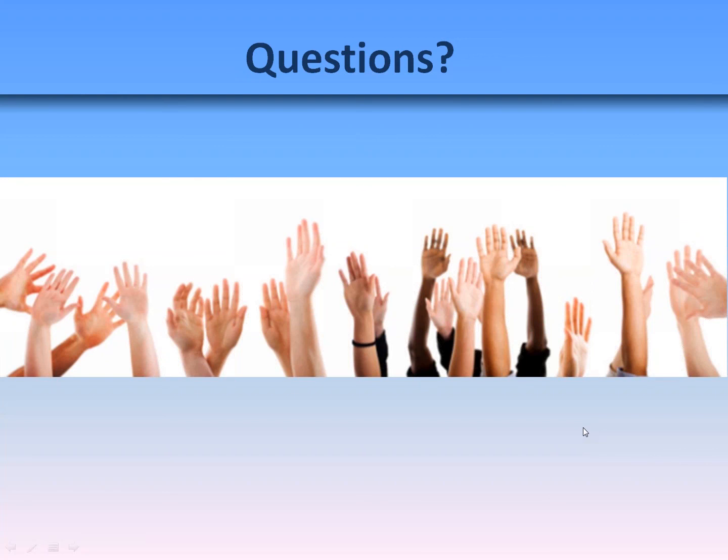Stephen asked, how important do you feel it is to use the 2-week phase before Propel? I've been using Propel prior to aligner 1. I think it probably is, again, I'm going more from the science there, Stephen. I just have to share with you that I kind of like to honor Burstone's phases of tooth movement. I can't say, because this is all going to be anecdotal, I can't say that there's any disadvantage to it.